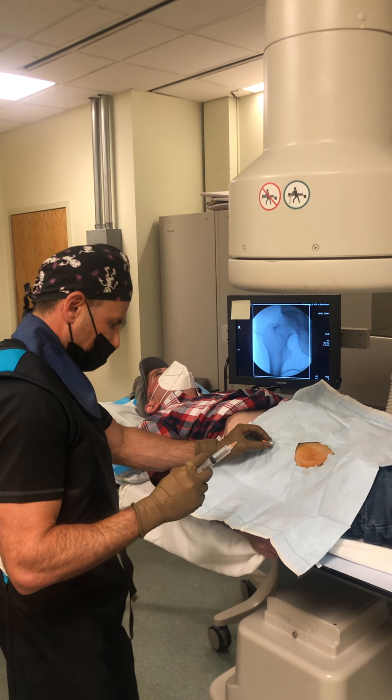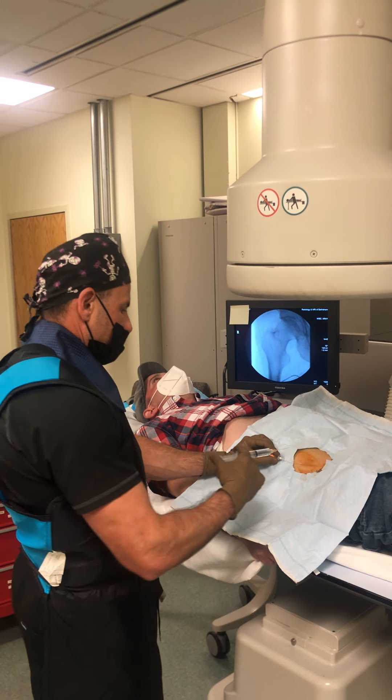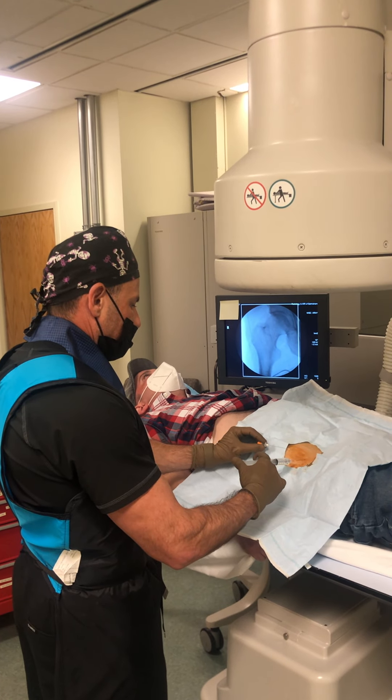First we're going to localize the hip area, which we did with x-ray, and place a small needle. Here's some numbing.